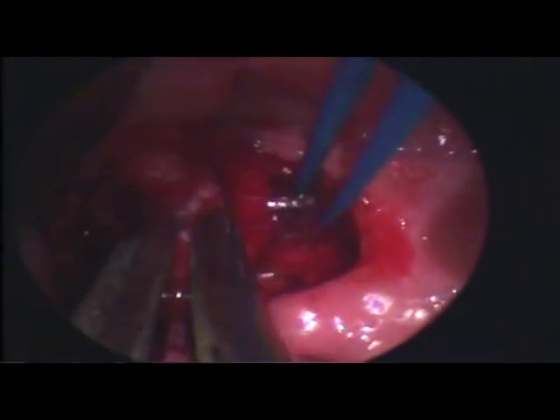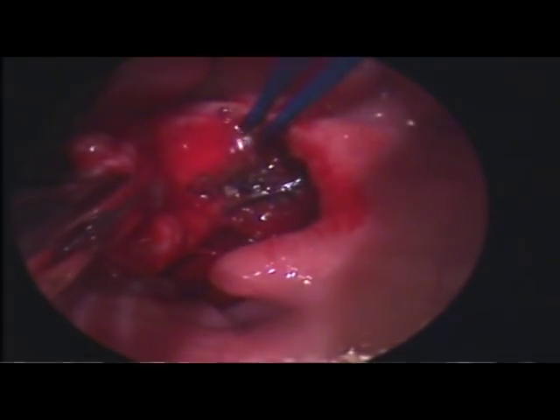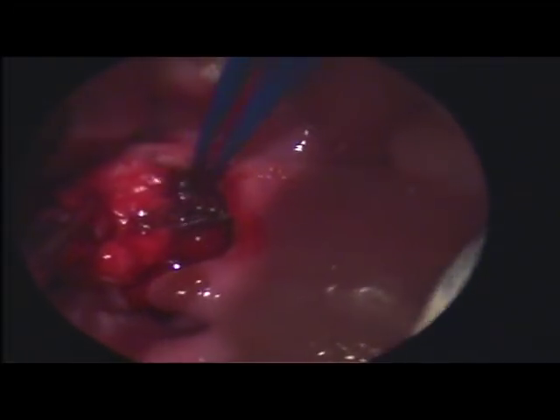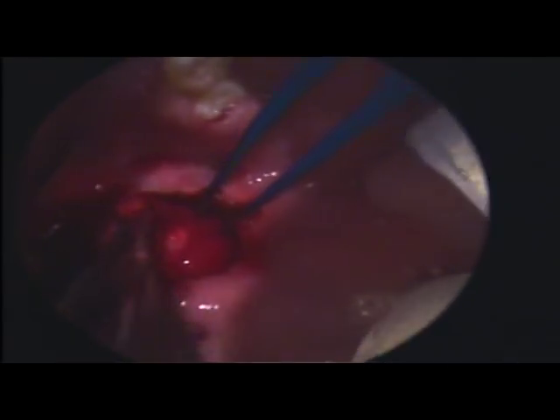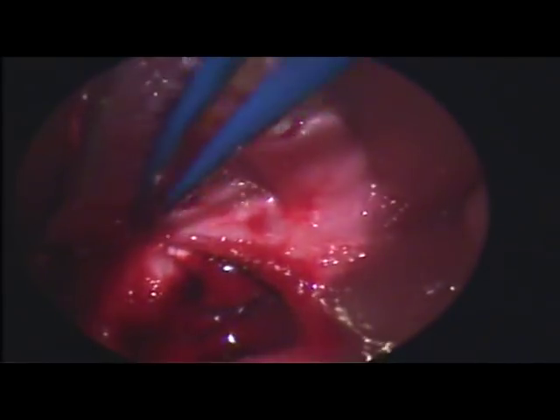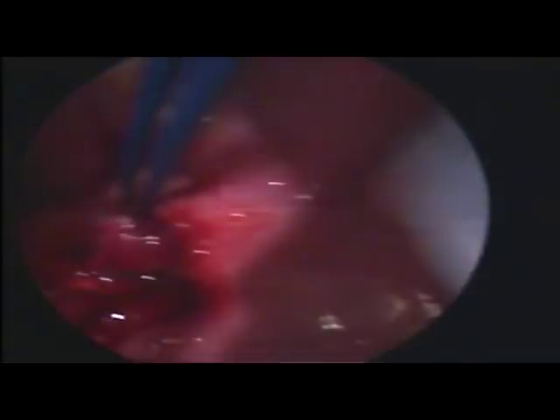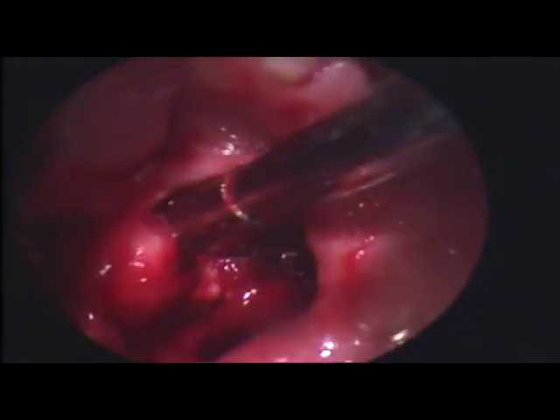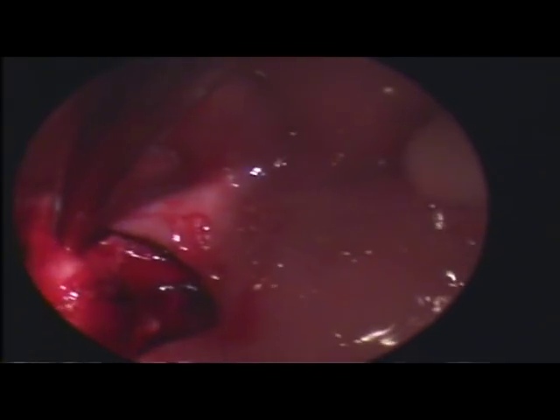When obvious blood vessels are encountered, the blood vessels are diathermized. Every now and then, suctioning needs to be done to ensure good visualization.